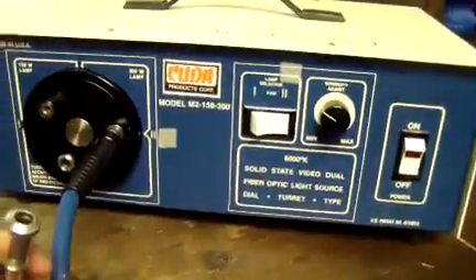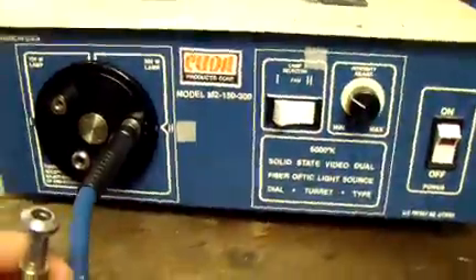Hey, it's DCSP Medical. We're looking at a CUDA M2 light source — the 150 watt and 300 watt lamp.